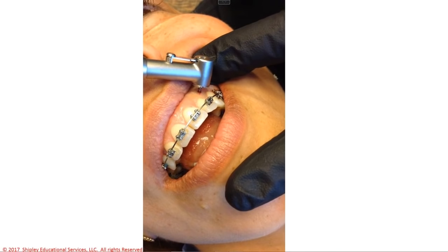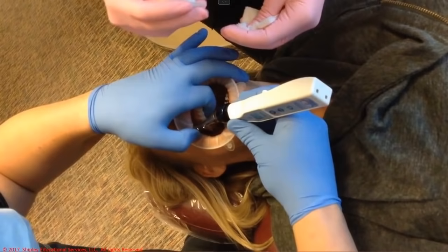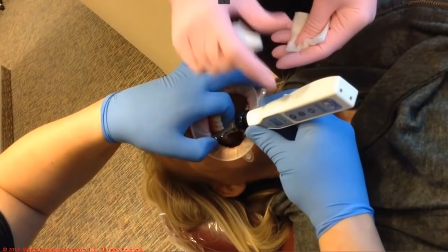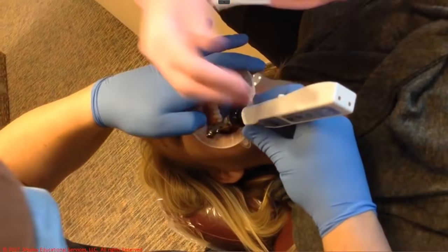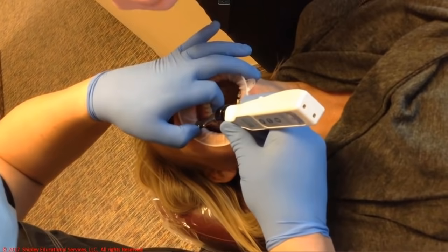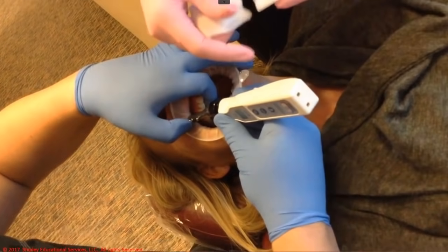Here's another patient. Now, if you have a difficult area where you're trying to place the MOPs, look at my hand technique here. I've got my left index finger on the palate, and then I've got my thumb on the head of the driver. I'm doing a squeezing action with my fingers to help squeeze the driver into the area. So if you have some tough bone, this is a technique that you can do to get it to drive into that area.